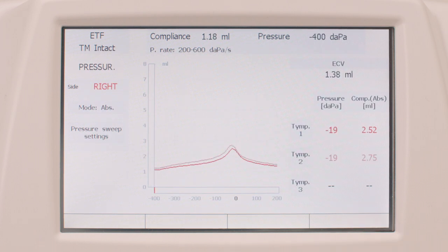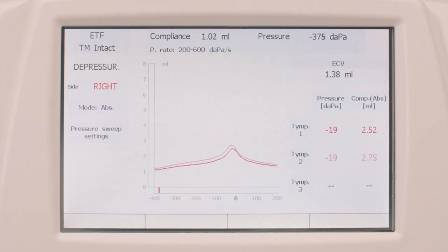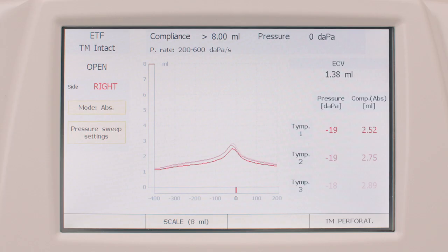The same procedure will be repeated for the recording of the third tympanogram. Results of the examination are shown on the right of the window, where the ear canal volume and the peak pressure values of the three tympanogram acquisitions will be displayed.